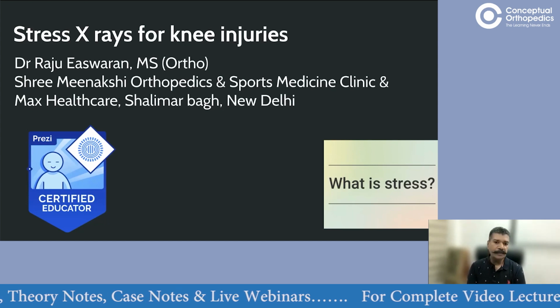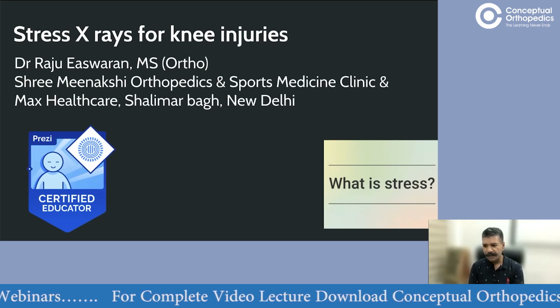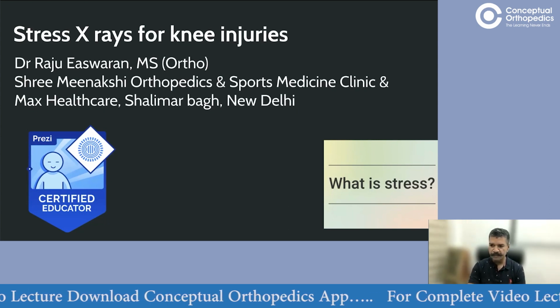And if you build up on the series of lectures that I have already taken on the biomechanics of the knee, the role of these individual ligaments, you will probably breeze through this talk because it is basically a radiological extension of what has already been spoken about.